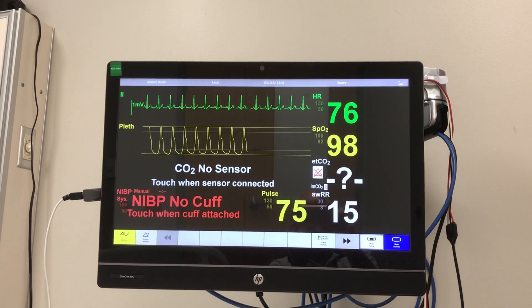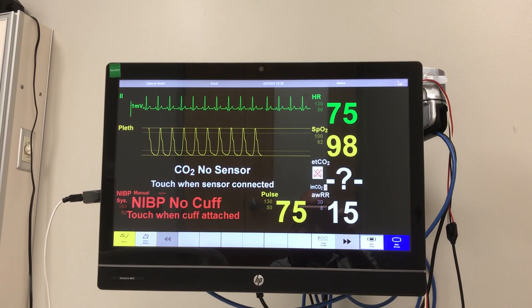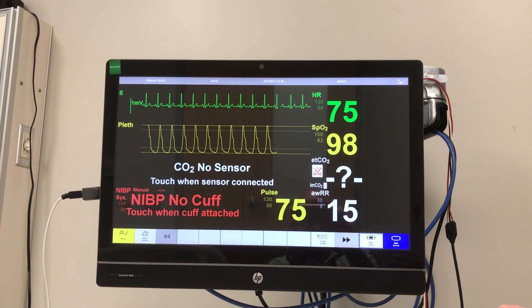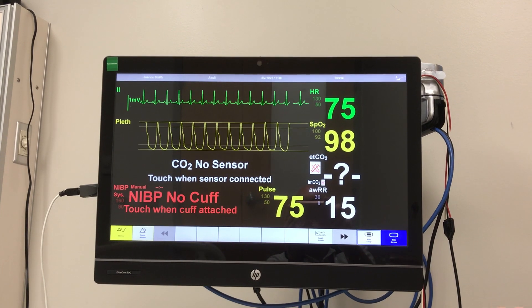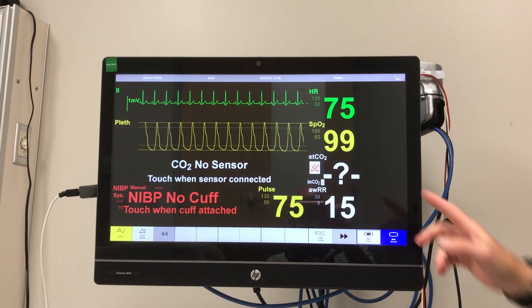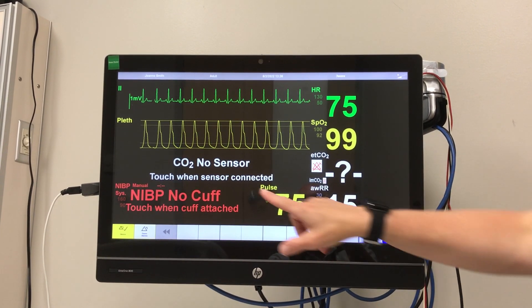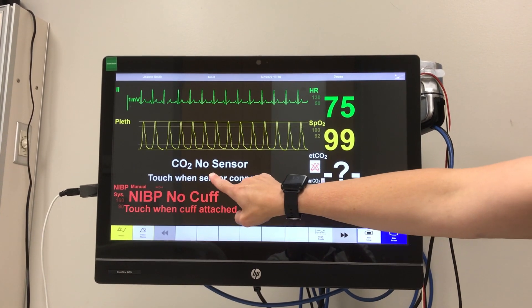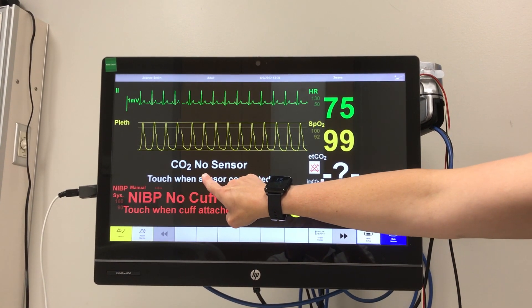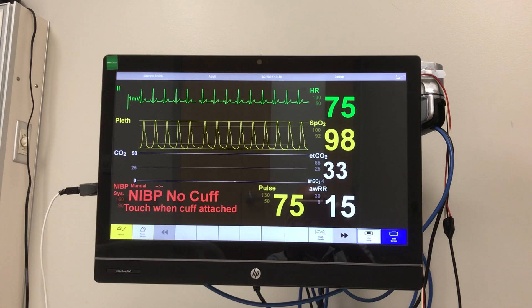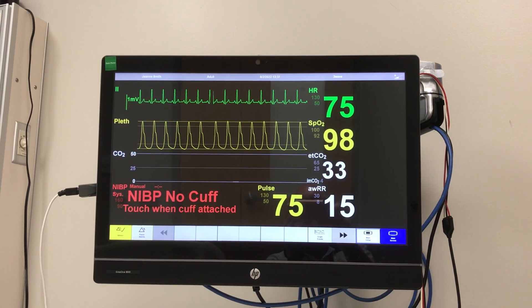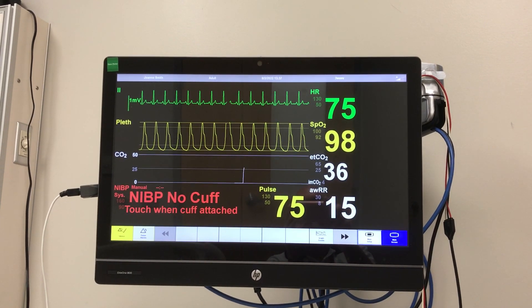The next one here is end tidal CO2. That's not used for every simulation, but if it is, you'll have it available. Once it's attached, you just touch there and you're going to get a reading for that as well.